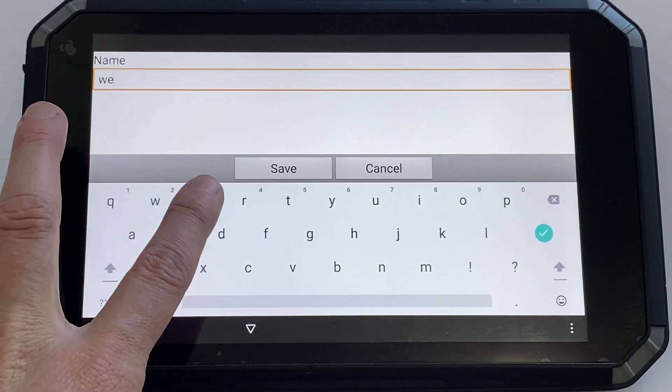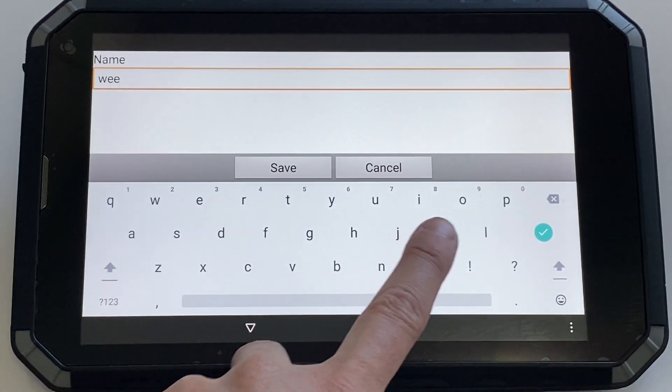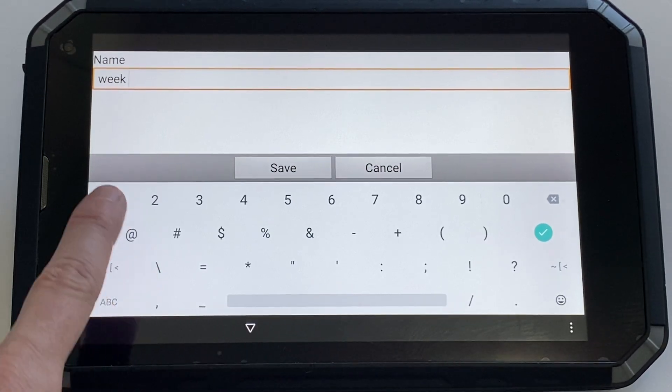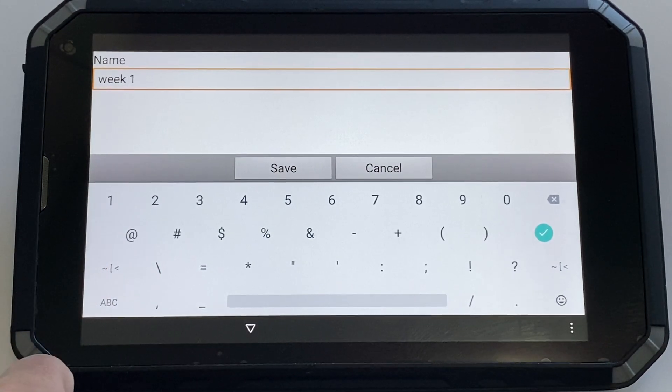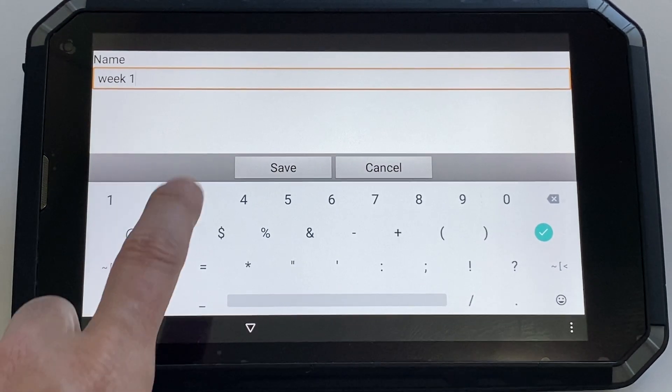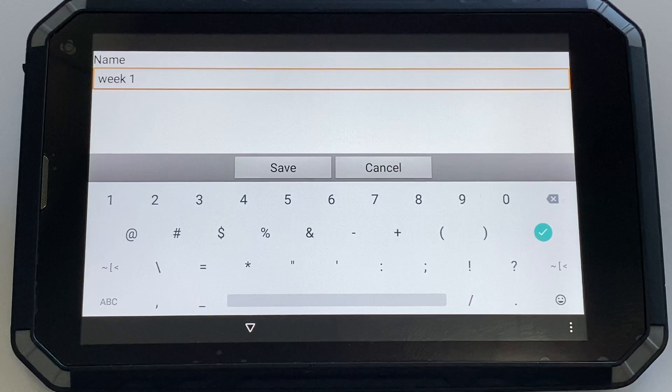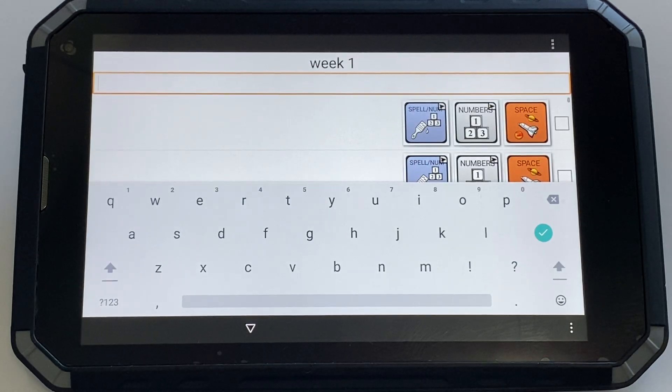You might have a list of words for maybe week one of your trial that you're focusing on. I'm going to call it week one and hit save.